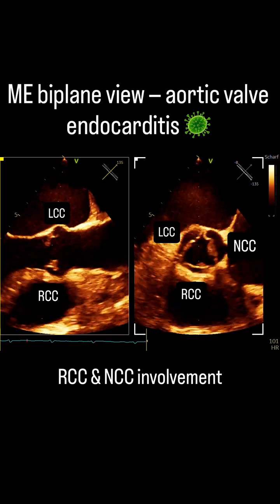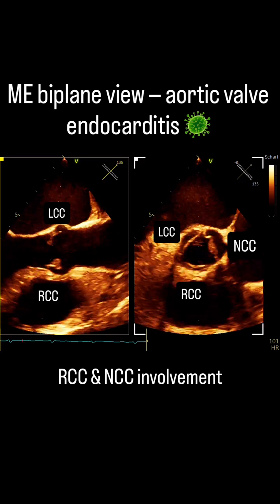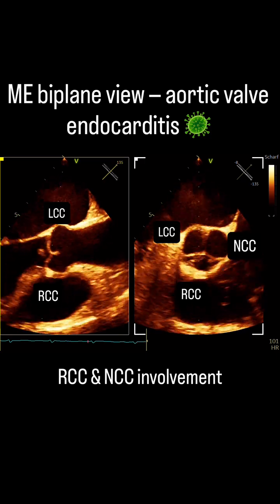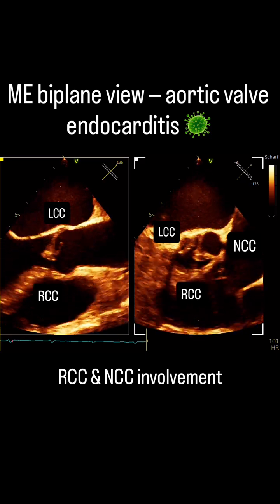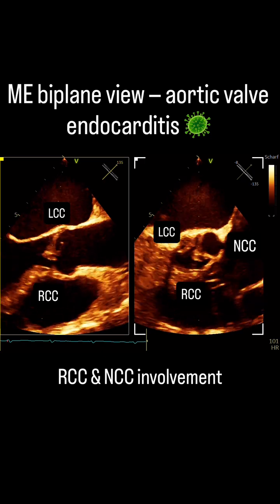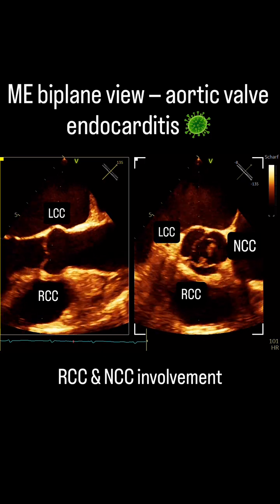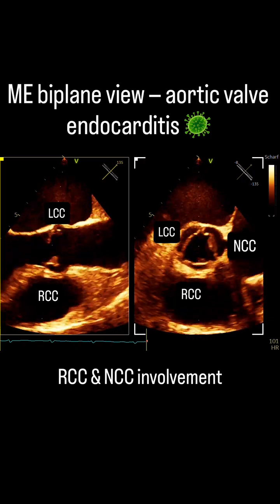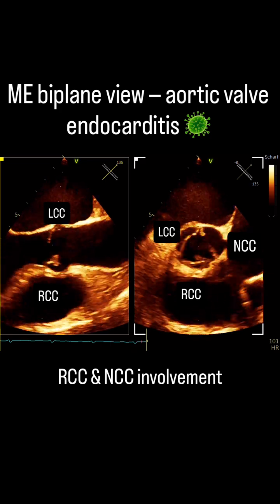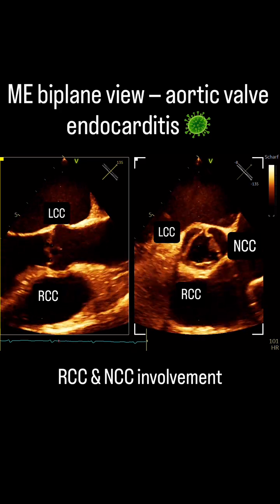On the right-hand side, we can orient to the non-coronary cusp. It's also a pathological finding where we see the endocarditis on the NCC, but also on the right coronary cusp. The left coronary cusp appears to be without any kind of lesion.